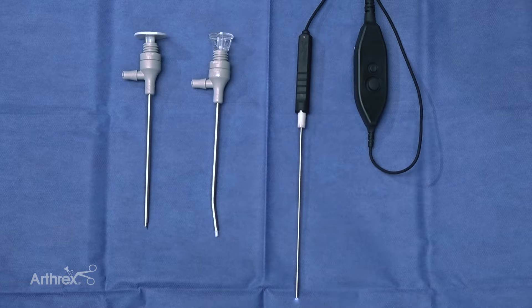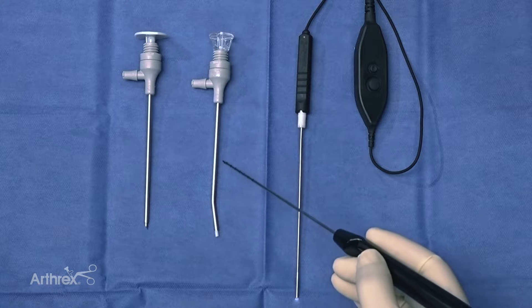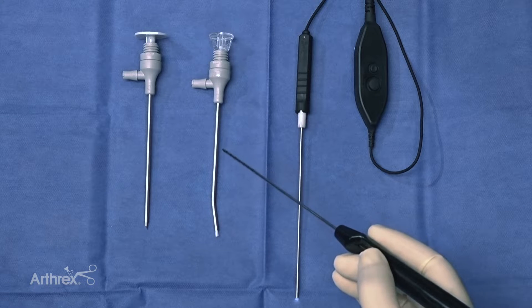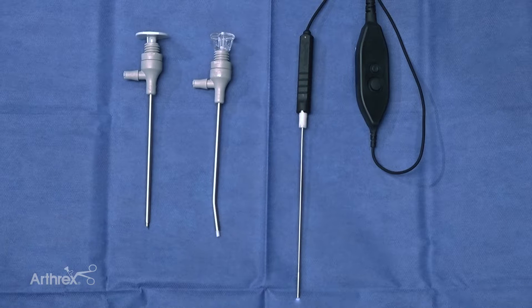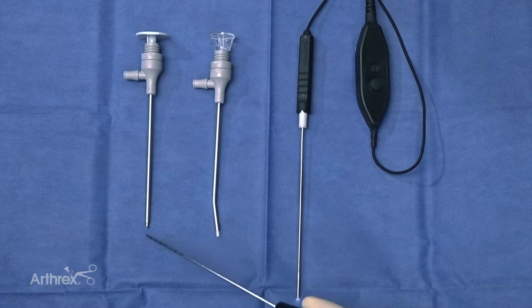It's a little bit more versatile in that the buttons are detached, still with video and picture capability. We're going to be using the 3.3 high flow sheath today — one straight, one angled. And we have the option of a dull and a sharp obturator.